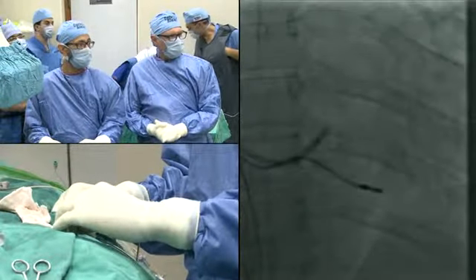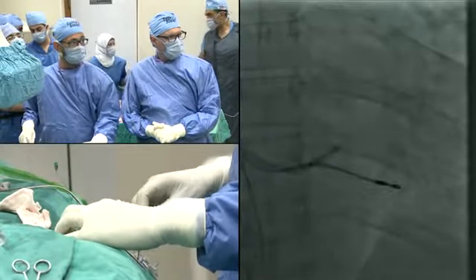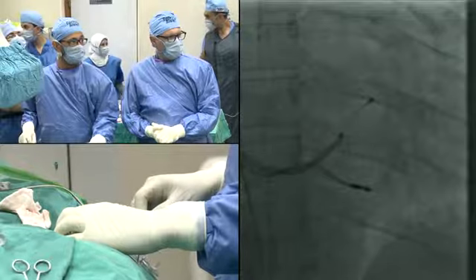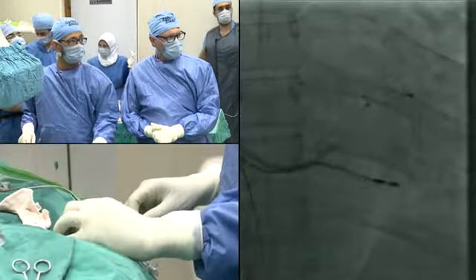Now this is a good position too. Looks nice. So if the other vein was not optimal, I would never try to change the position. But this vein is small. I hope the lead can pass easily inside it. Looking good. Okay, very good. It goes. And then I will try to correct the position of the wire.